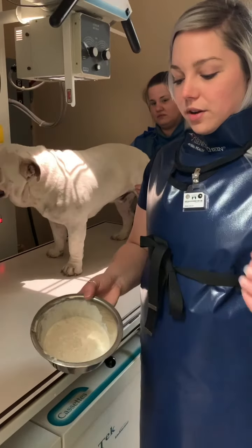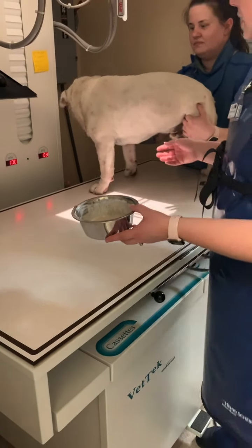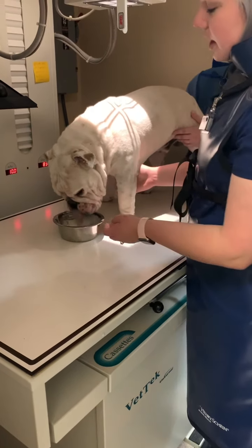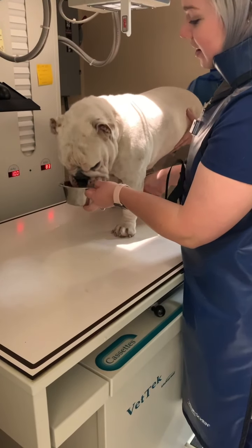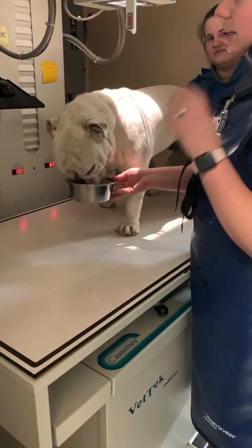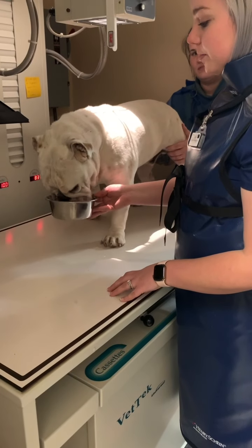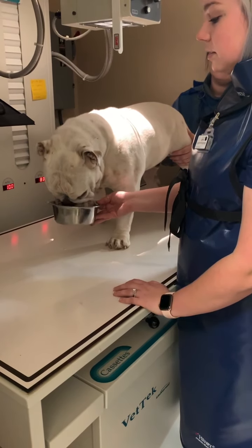Now we have our canned food with the barium, and we're going to let him eat it. We already have our x-ray set up to be ready as soon as he's done eating. We want to take the x-ray so we get it in the esophagus to make sure he doesn't have megaesophagus.